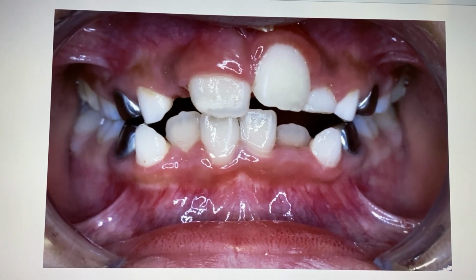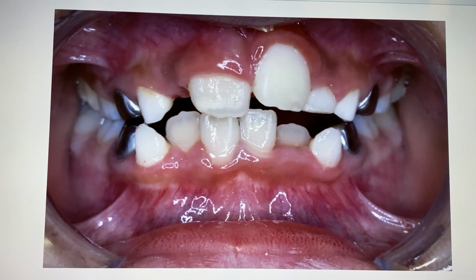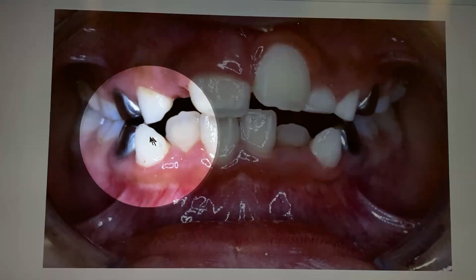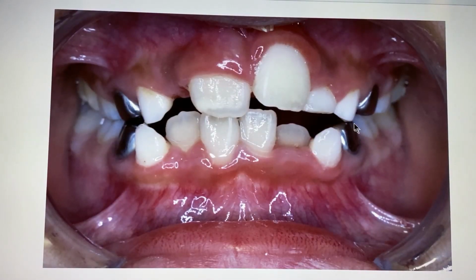Here's a case with severe crowding in a young child. She still has most of her baby teeth present. You can see the arches are very narrow and all the back teeth are tucked in at the back. Now she was told by her dentist and another orthodontist that 8 of her baby teeth, including 4 of her adult teeth, need to be removed to help solve these crowding issues.